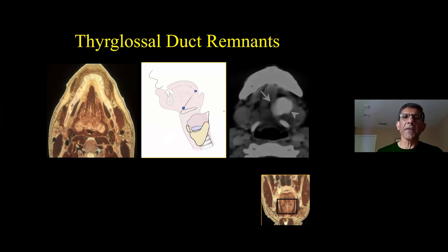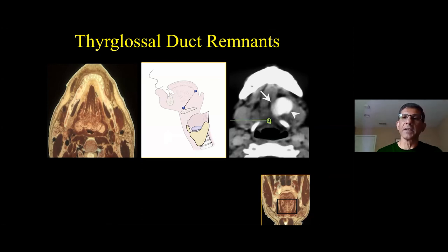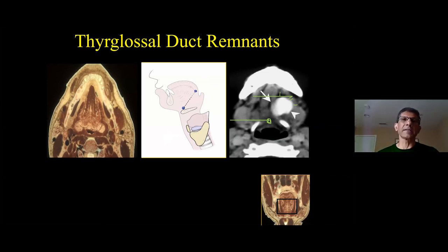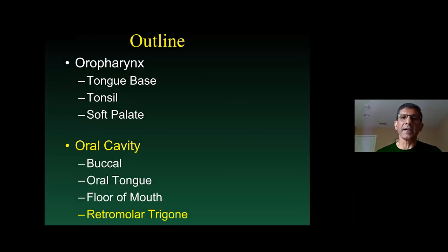We talked about thyroglossal duct remnants earlier at the tongue base — the foramen cecum. This is an example of a thyroglossal duct remnant extending inferiorly, leaving little droplets of tissue involving the floor of the mouth. How do we know it's thyroglossal duct remnant? Because it is very, very dense on a non-contrast CT — remember, the thyroid gland concentrates iodine.